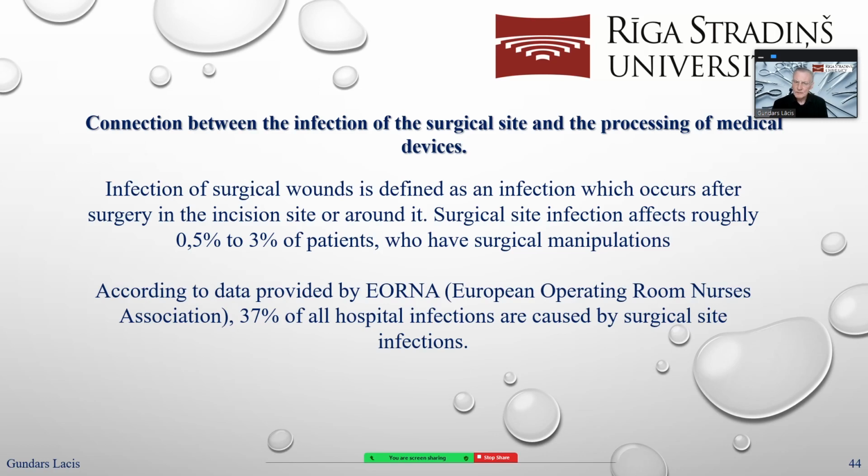Tricky is that it's really difficult to say where the real reason is, because after manipulation rooms are cleaned, maybe even disinfected, the team at least washes hands, and instruments are reprocessed.